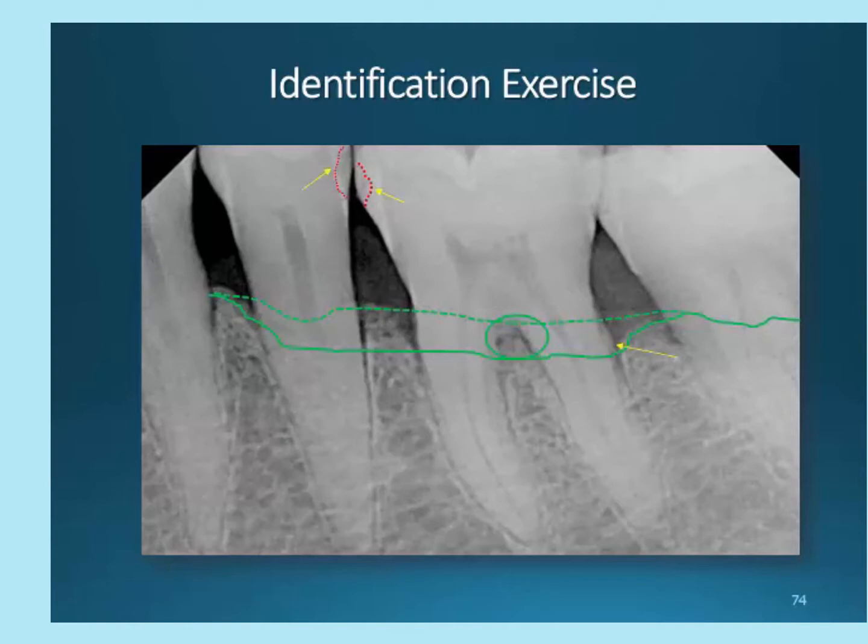Now, what kind of classification do you find these carious lesions to be? If you guessed stage 2 on the mesial of number 19, you are correct. The progression is only in the enamel and not more than halfway through. Now on the distal of tooth number 20, I would say the classification is a 3. It is beyond the midline in the enamel and getting closer to the DEJ.